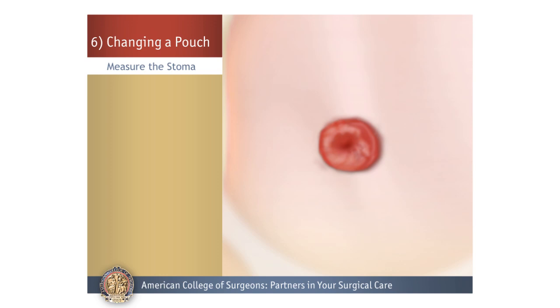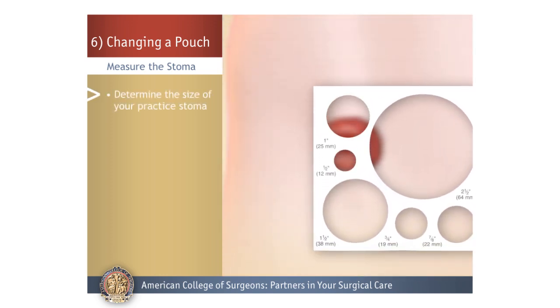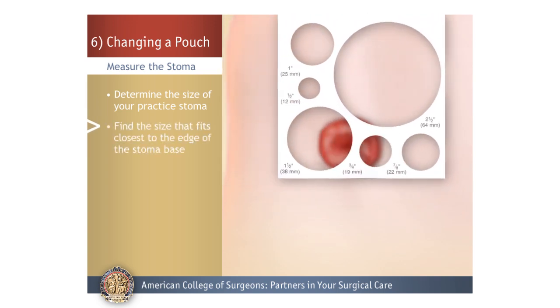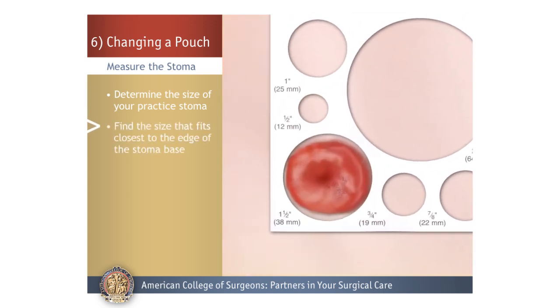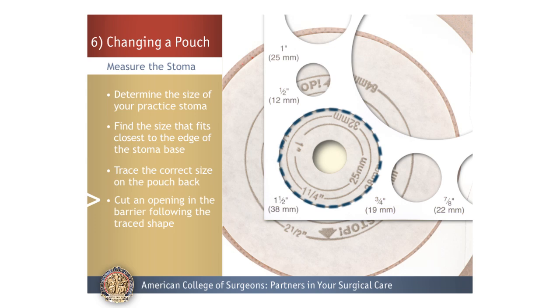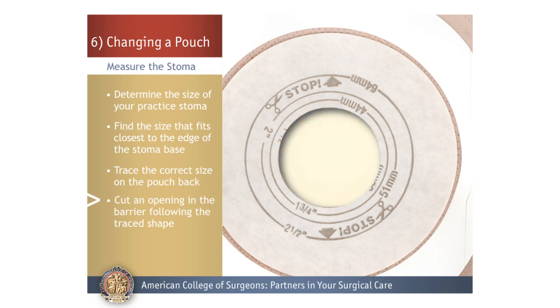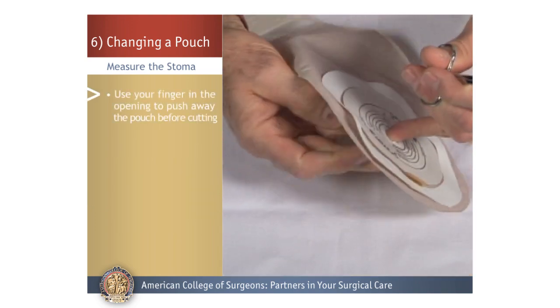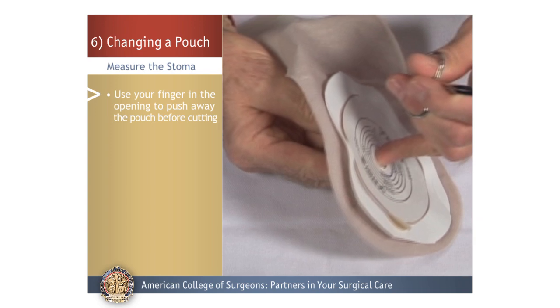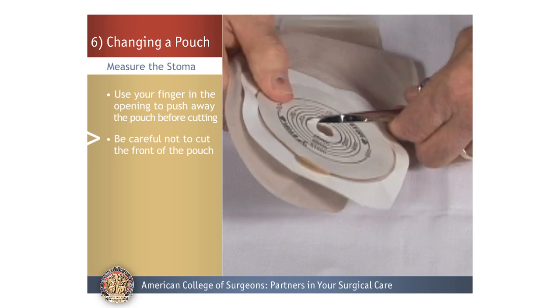Measure the Stoma: Use your sizing template and determine the size of your stoma using the practice model. Find the size that fits closest to the edge of the stoma where the skin and the stoma meet. Next, place the template on the back of the pouch barrier and trace the correct size. Use scissors to cut an opening in the barrier closely following the traced shape. If you are using a one-piece pouch system, place your finger into the small pre-cut opening and push away the pouch before you start to cut. Be careful not to cut through the front of the pouch.